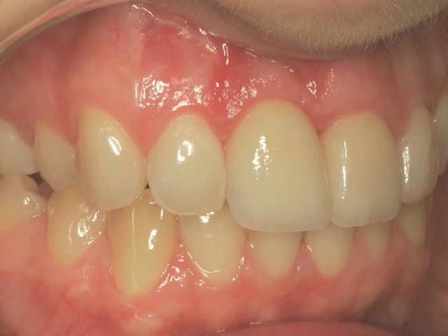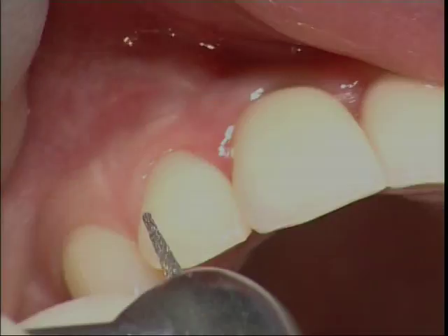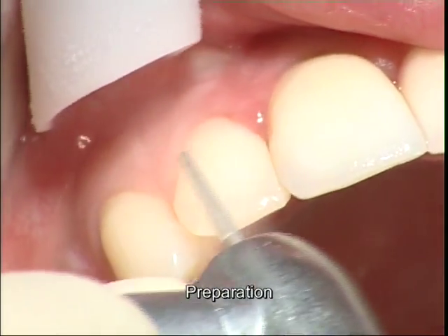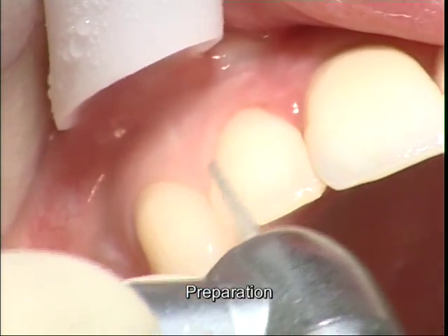Now she wanted the other lateral, which we had been discussing before, to be veneered. So we are using the pointed instruments, a pointed diamond, removing a very superficial layer of porcelain in the cervical area.